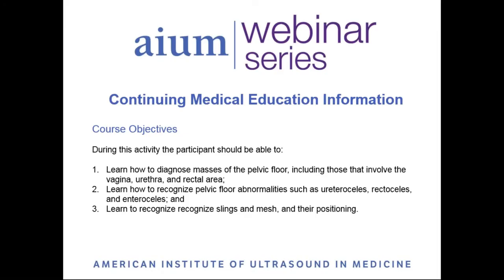During tonight's presentation, participants will learn how to diagnose masses of the pelvic floor, to recognize pelvic floor abnormalities, and recognize slings and mesh and their positioning.